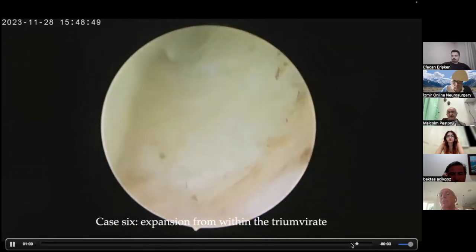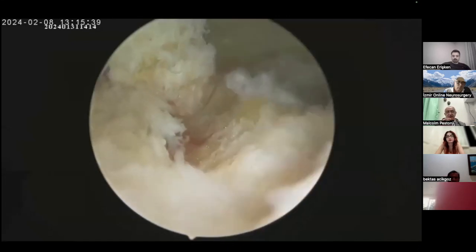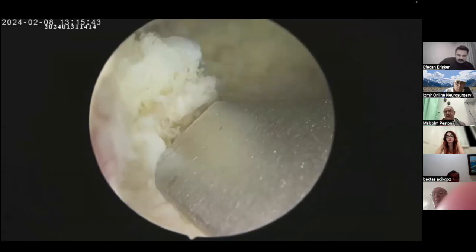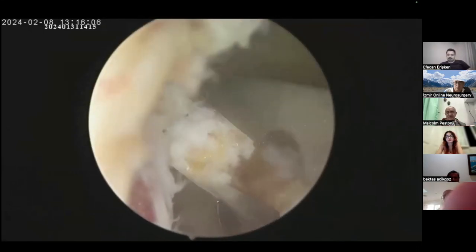So this is entering into the disc. So I'll just skip this video because I've shown you enough of this. This is again a different side. You can see that I'm going by the side of the root down below, fracturing. And then again, the same procedure being repeated.